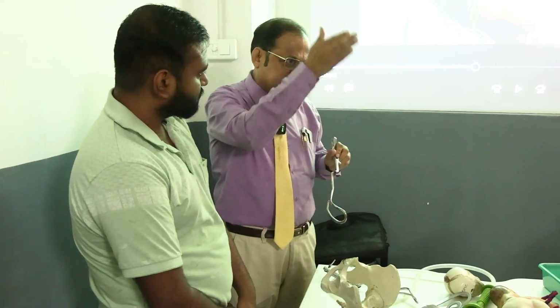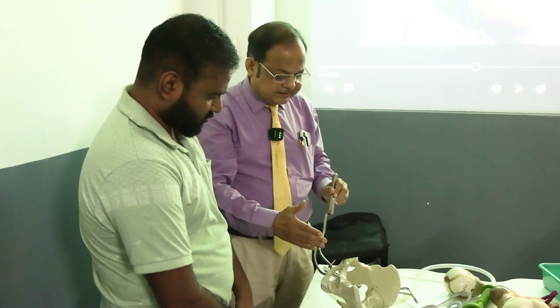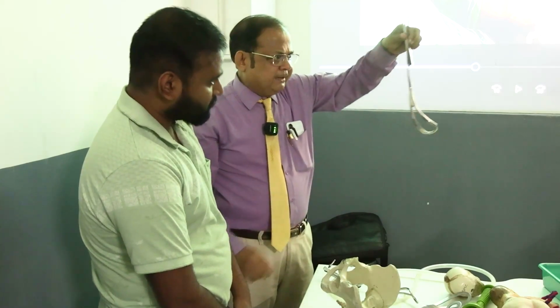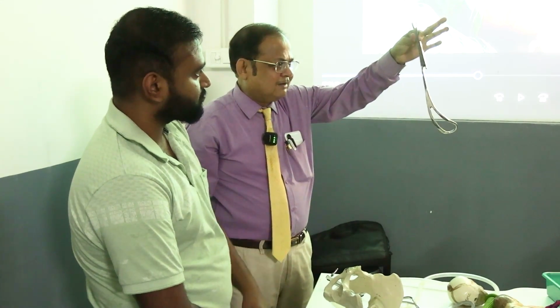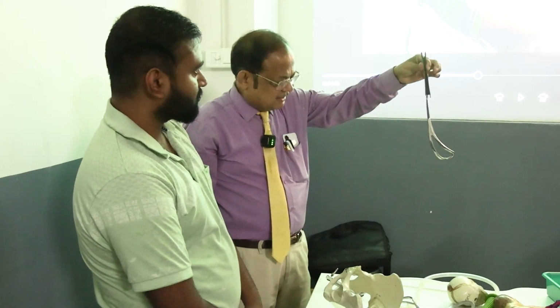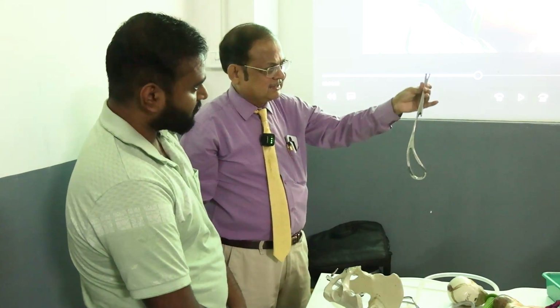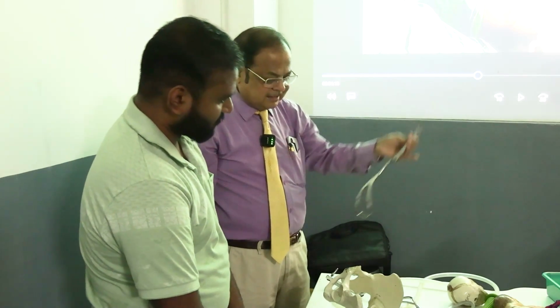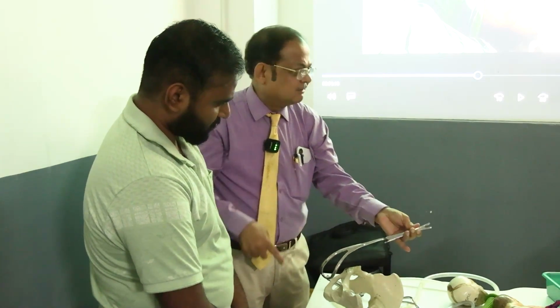If the sagittal suture is direct anteroposterior, no problem. If criteria are fulfilled, use the pen holding fashion like this, with thumb, index and middle finger. After the end of the class, you will practice with a video. And the left blade is held parallel, at a right angle like that.